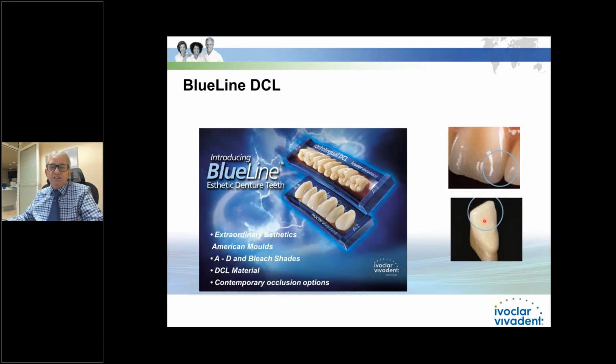The lower anteriors, I really like. It is a flat, slanted incisal edge. And why I like that is when you're going to incise, it's kind of like a ramp. If you have a patient that sews, that's exactly what you want. You want that ramp, because if you have a rounded edge, they can't bite the thread. They can't incise their food very well. I like how this slides so smooth instead of having a rounded edge. So I really like that.